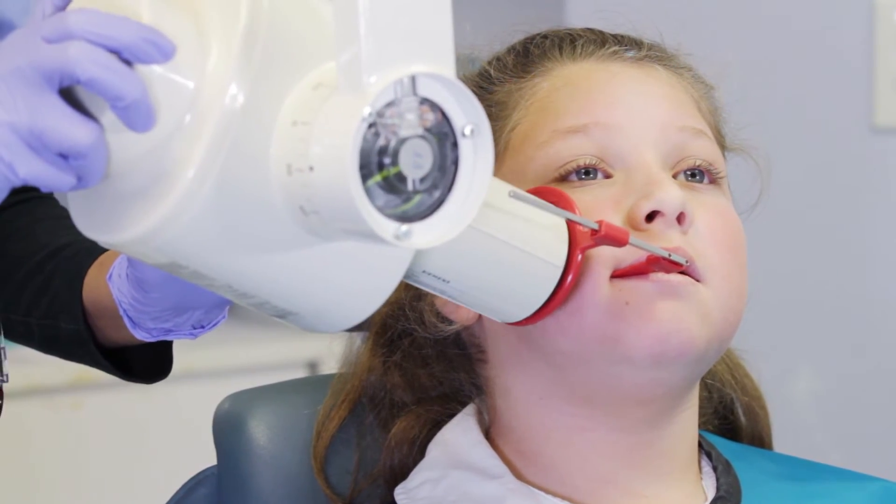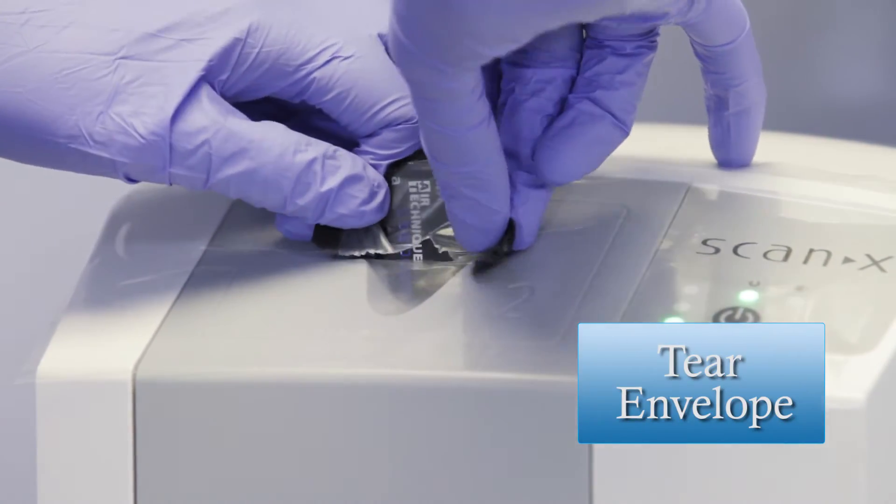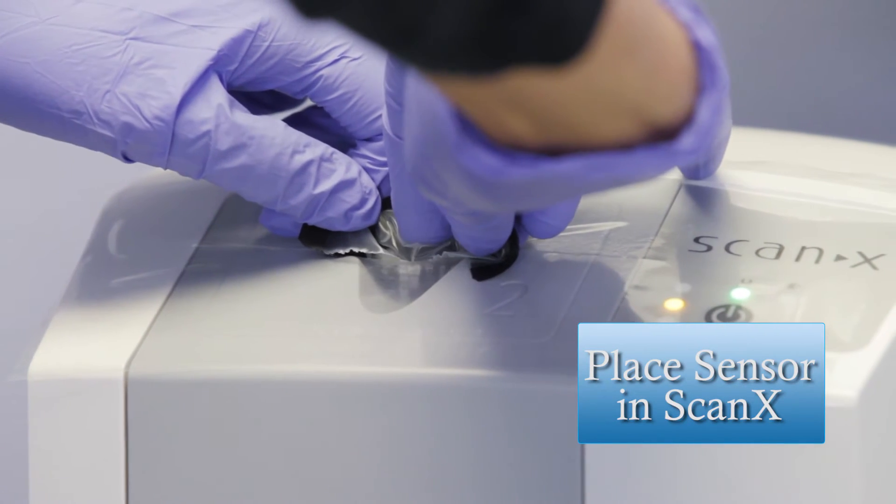Once the x-ray is complete, tear the bottom of the barrier envelope to remove the PSP and place it into the opening.